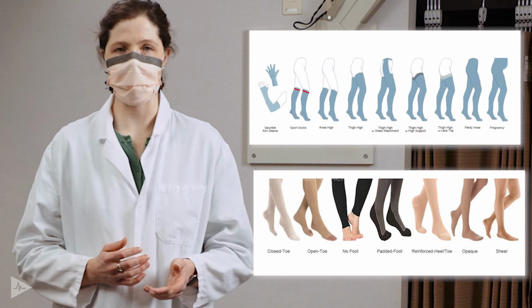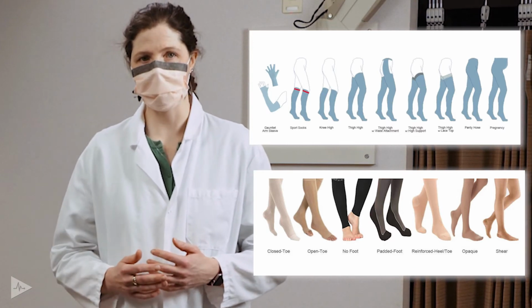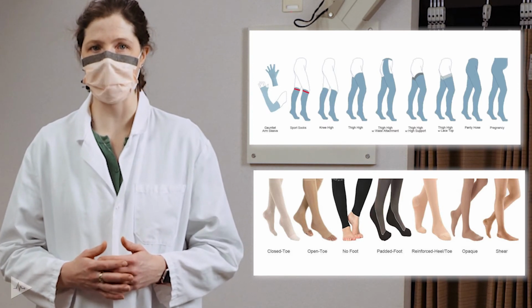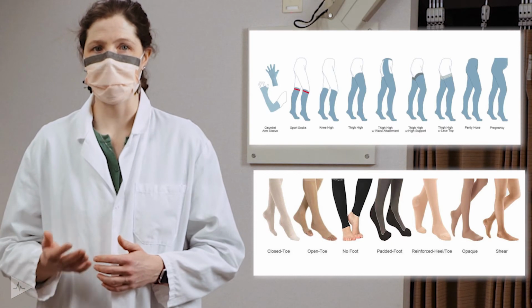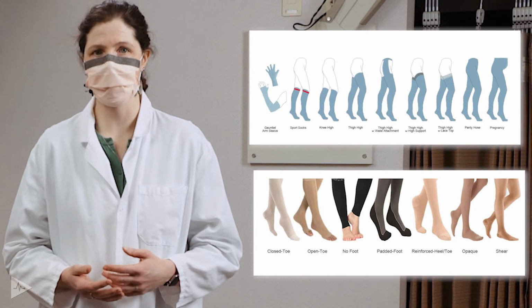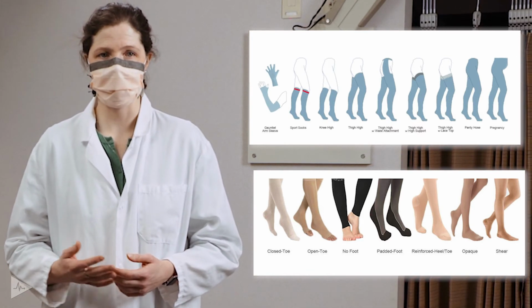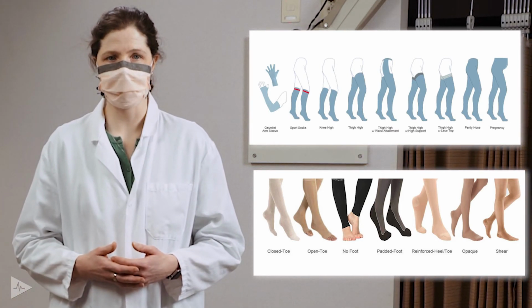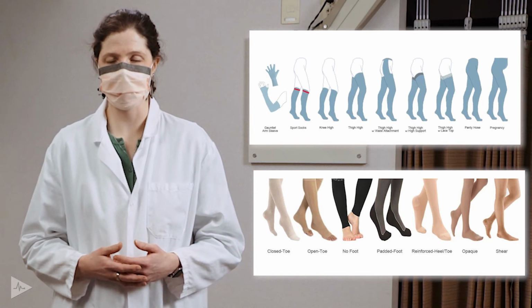If we are going into a maintenance mode, then we will use compression stockings. Medical grade compression starts at a 20-30 strength, and you can also escalate that to a 30-40 strength. There are many different lengths of compression. When focusing on edema control, a knee-high compression stocking is generally adequate. We can progress to a thigh-high compression stocking for patients with proximal wounds, varicose veins, or significant venous disease. Then you can also use a pantyhose waist-high length as well, or there are also capri options often used in more of a lymphedema setting.